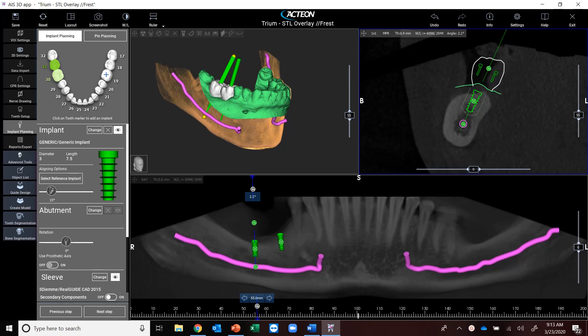As you can see on my screen here, I've already got a case opened up. I've already planned for implants number 31 and 30. What I want to show you guys today is the new module that we will be releasing very shortly for guide design.